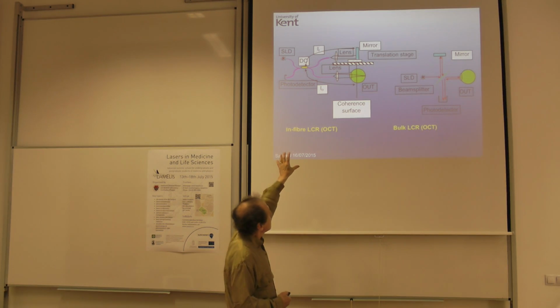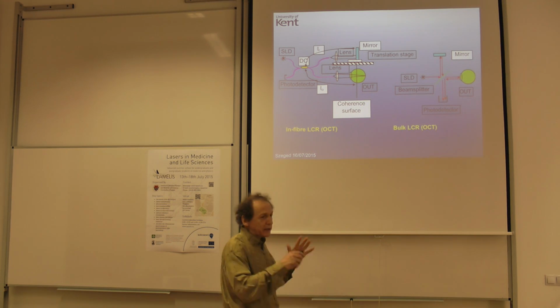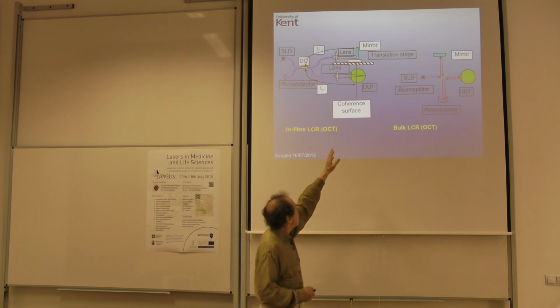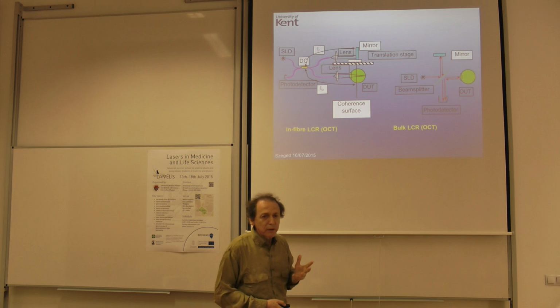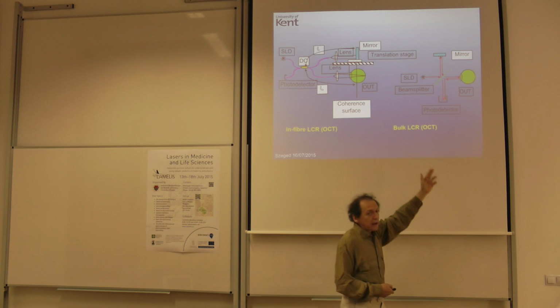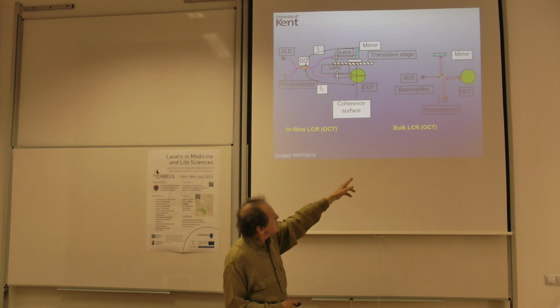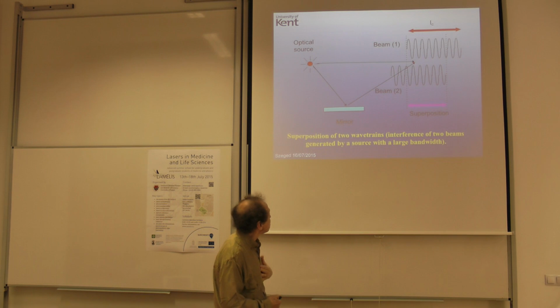Technicalities now, you see here how we do an interferometer. So you take light from a superluminescent diode, which emits a large spectrum. The spectrum being large is essential for the technology. Divided into two, one to the object under test, OUT, and there is another beam. So that is the difference from a microscope. You add another beam from a reference mirror. You superpose that beam with the beam coming from your object, and you do interference. Or you can do it in bulk, in free space. That green line, you show a beam splitter, you divide the beam into two. So now, when the beam comes back, it goes to the photodetector. And that is the core principle of an optical coherence tomograph.